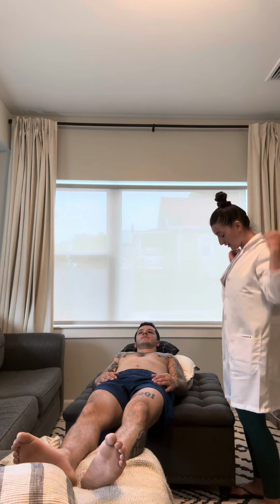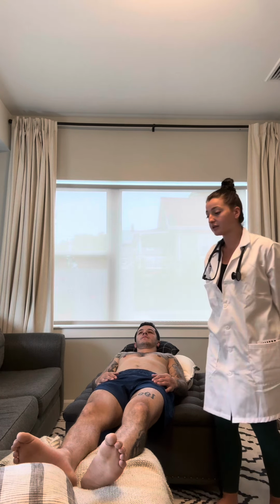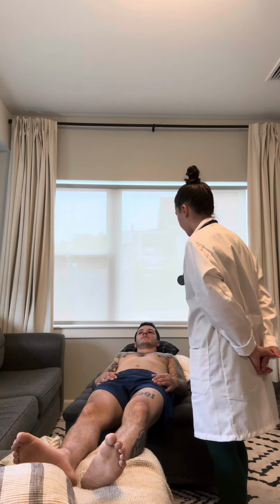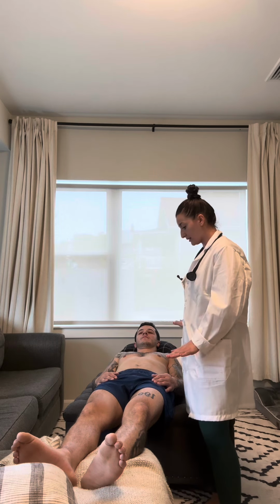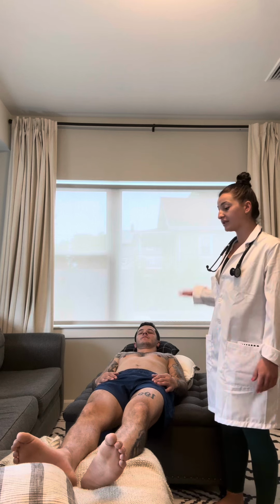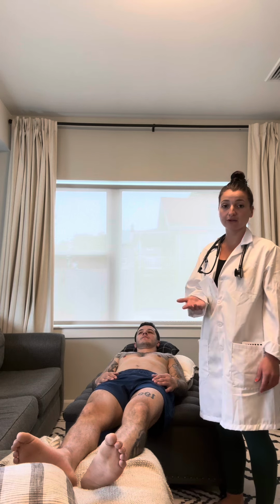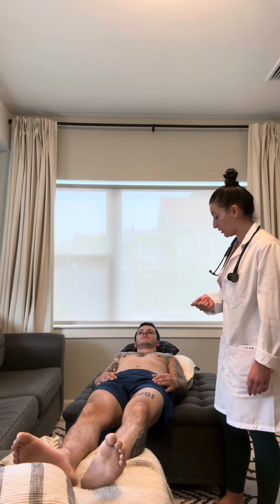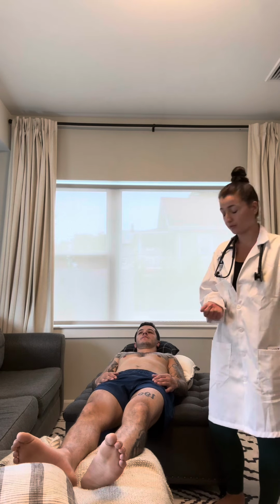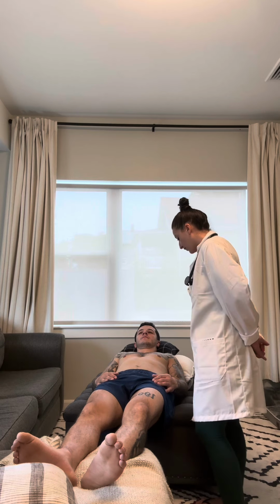So now that we've completed the auscultation portion of the exam, I'm going to be verbalizing and conducting some special tests during cardiovascular assessment. So with orthostatic blood pressures, you want the patient to lie just the way Nolan's laying, in a supine position, take their blood pressure and their heart rate. Then you're going to have them sitting, and you're going to measure their blood pressure and heart rate, and then you're going to finally have them standing. And what you're looking for is a 20 millimeter of mercury decrease in their blood pressure, and that will confirm a positive orthostatic sign.